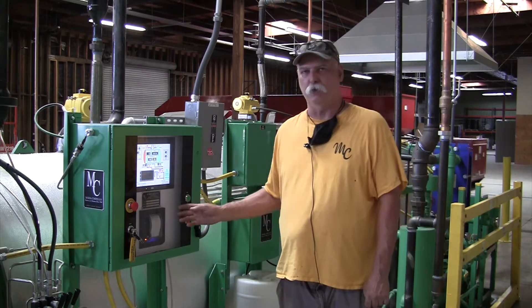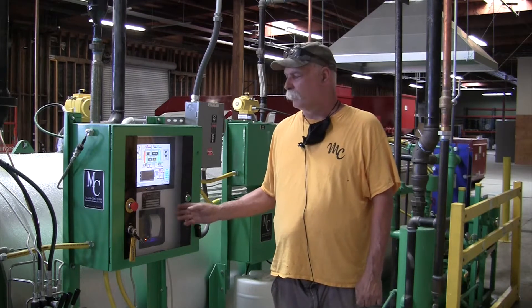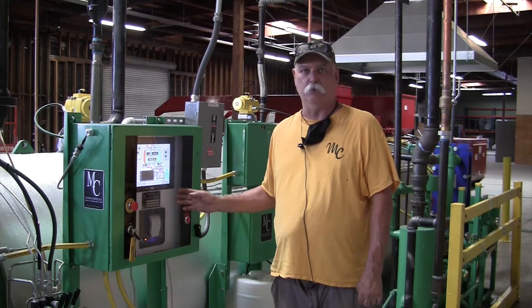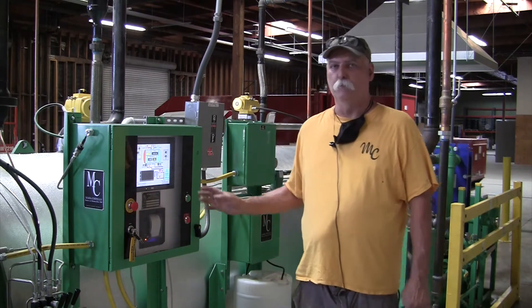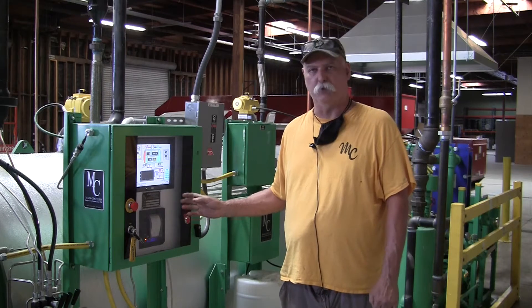This particular sterilizer has a dual mode controller. It will do full condensing vacuum, it will do gravity assist and gravity mode, all at the touch of a button. For this particular demonstration, we're going to show it in gravity assist mode.